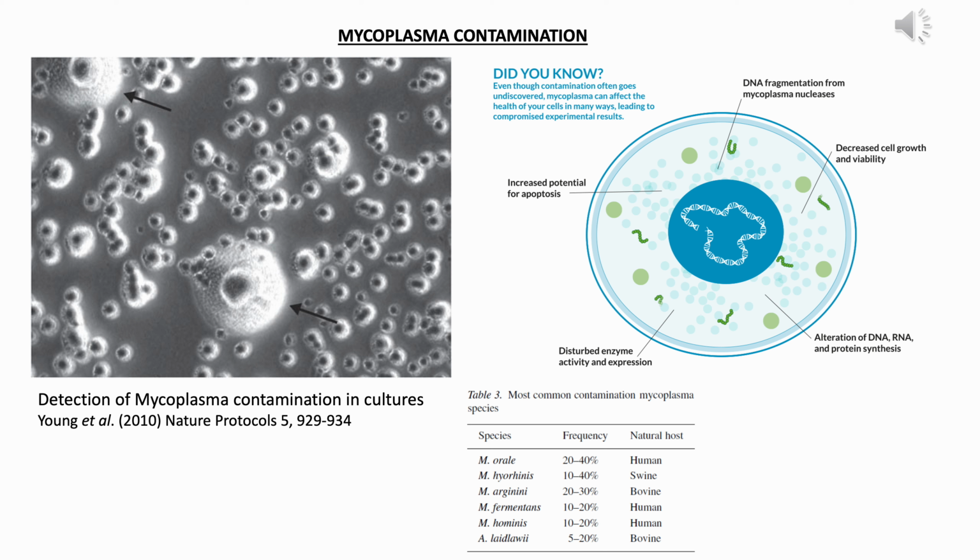Some cells may die also. So whenever you see a change in experiments between what you have already established a few months ago and what is currently happening, then one has to be very careful, and one has to suspect whether Mycoplasma may be a cause for this. One has to definitely look for these things.